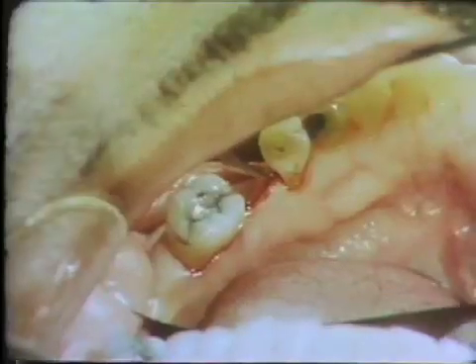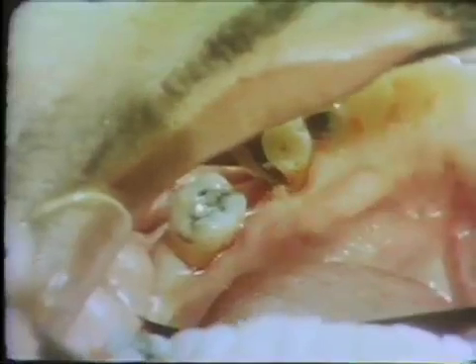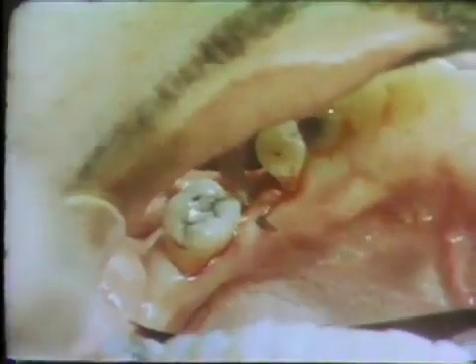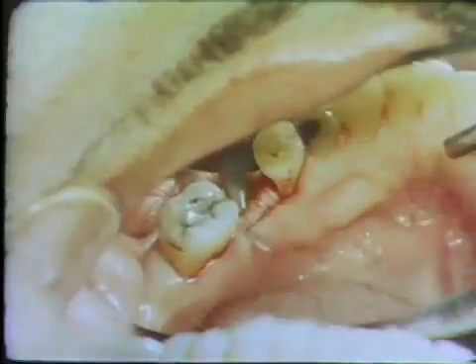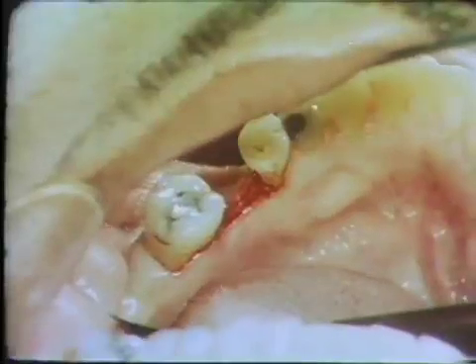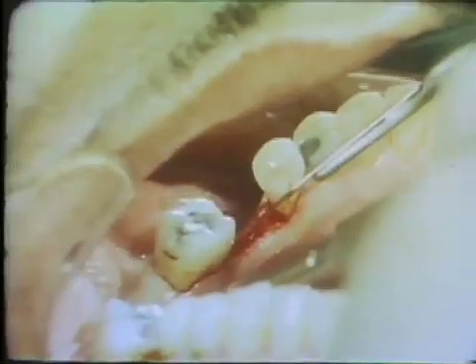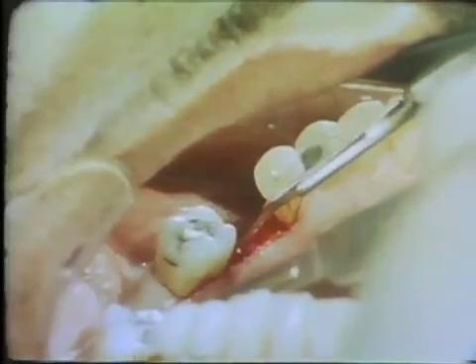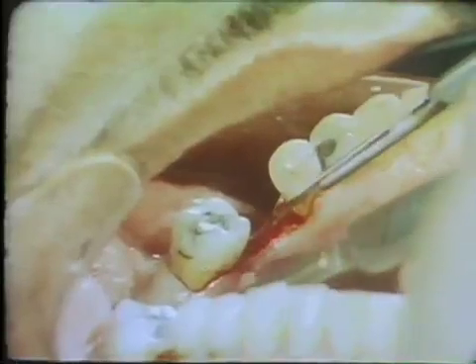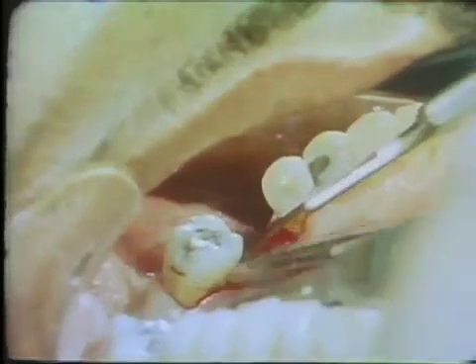The second incision is made with a Bard Parker No. 12B blade. It removes a strip of tissue from the external surface on the lingual aspect of the initial incision. This strip of tissue could be removed from either the buccal or the lingual side. The third incision undermines the tissue on the opposite side. The Bard Parker No. 12B blade is used to create a thinning of the flap. The excised tissue is removed.